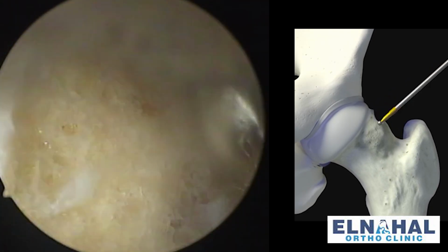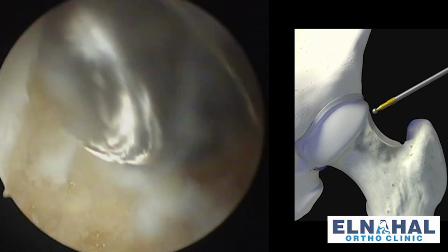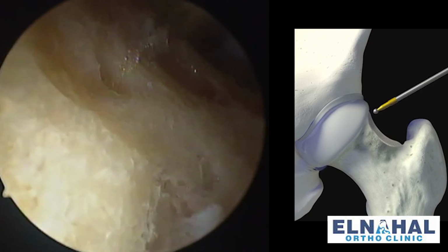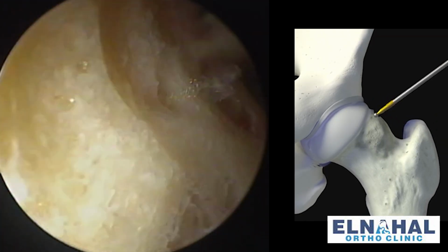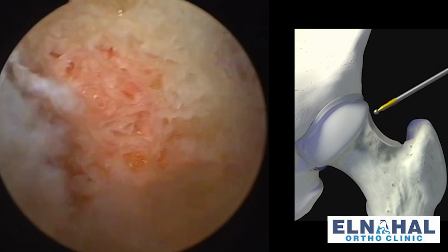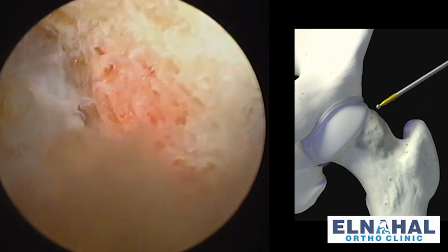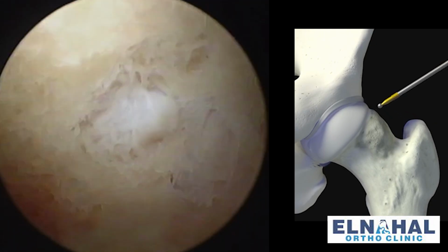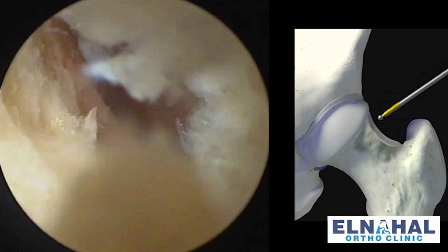We're now burring out the cam lesion, or the extra bone that caused the impingement between the head and the socket. We're not doing this just around the synovial or the impingement cyst. We're doing this all around the head, creating a slope downwards to prevent further impingement between the head and the socket.